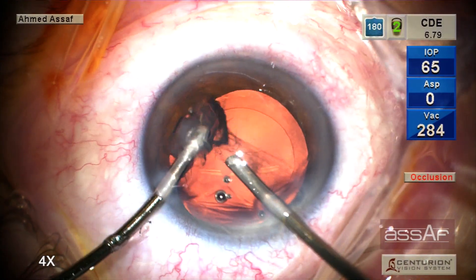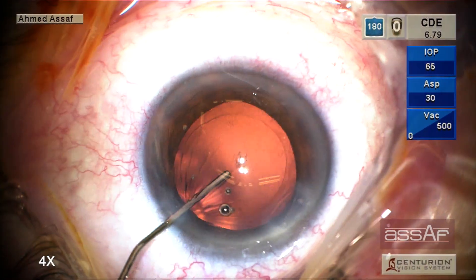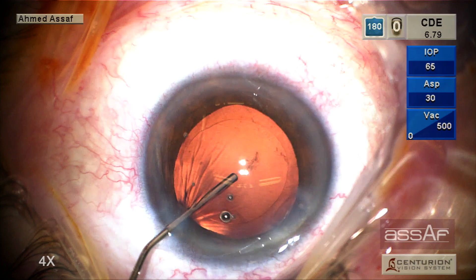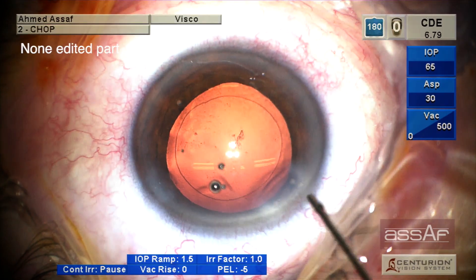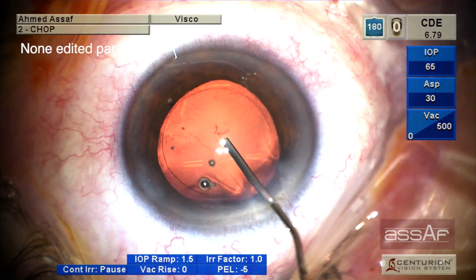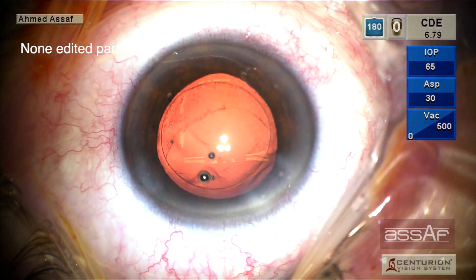Now this is the cortical cleanup, and while trying to irrigate some adherent cortical fibers to the posterior lens capsule, I had rupture of the posterior capsule.